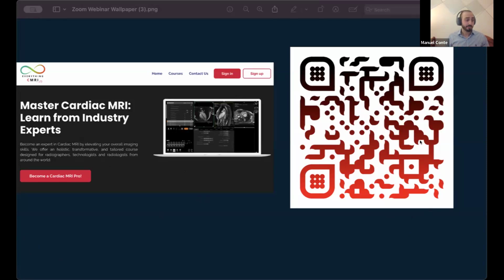Then also, the new implants are going to help a lot with that. So different materials will help a lot to reduce the metal artifact, and then it will depend on the implant. But if we have 0.5 and 3T with the same options, advanced technique, I would go for the 0.5, to be honest, in terms of safety, but also in terms of image quality, because the main point is to make the image diagnostic.